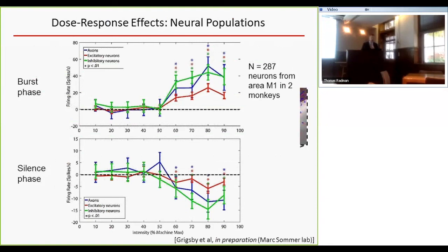Also, we're using relatively simple but robust tungsten electrodes that are just single channel, and from that, with data analysis, you can extract up to about 3 neurons at best by interpreting the amplitude of the waveforms. But you can also use more complex electrodes that have multiple contacts, for example going in depth, getting multiple contacts across layers, and that also may be an approach going forward.